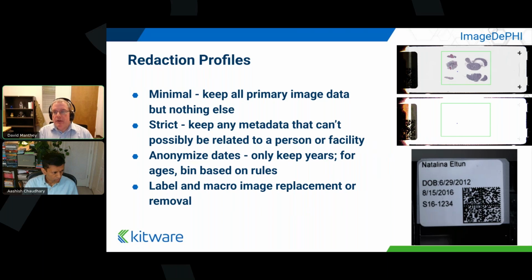So as an example, we have here a slide in the upper right that has an area of tissue. It shows the scanned area with that little box around it. And this is useful to see because, for instance, I can very quickly see that's not a needle biopsy. So I can tell what sort of biopsy it is just by looking at it. And so this has virtue. And I can see, oh, this is the overall scale. I know my slide was about 25 millimeters tall. Therefore, the tissue is a particular scale. All of that gives context.